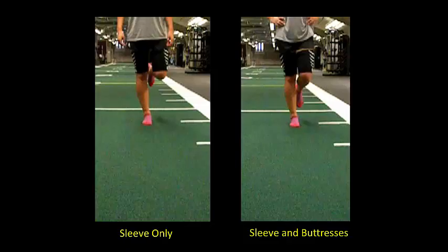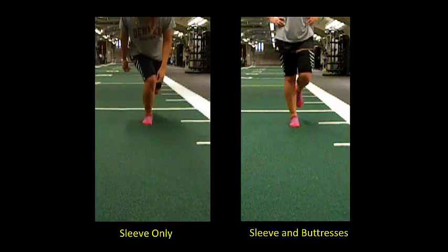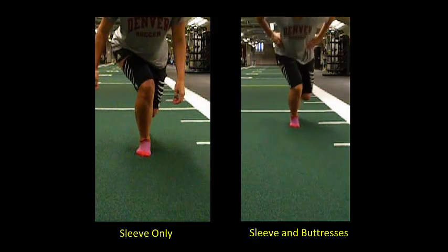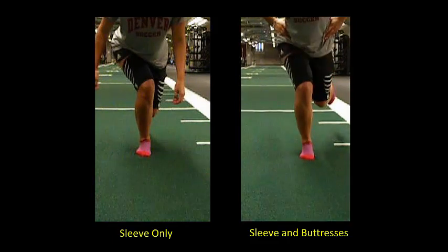Landing on a single leg from a horizontal distance equal to one leg length further demonstrates these improved leg movements, and also provides a visualization of the relationship between knee valgus and dynamic trunk control.